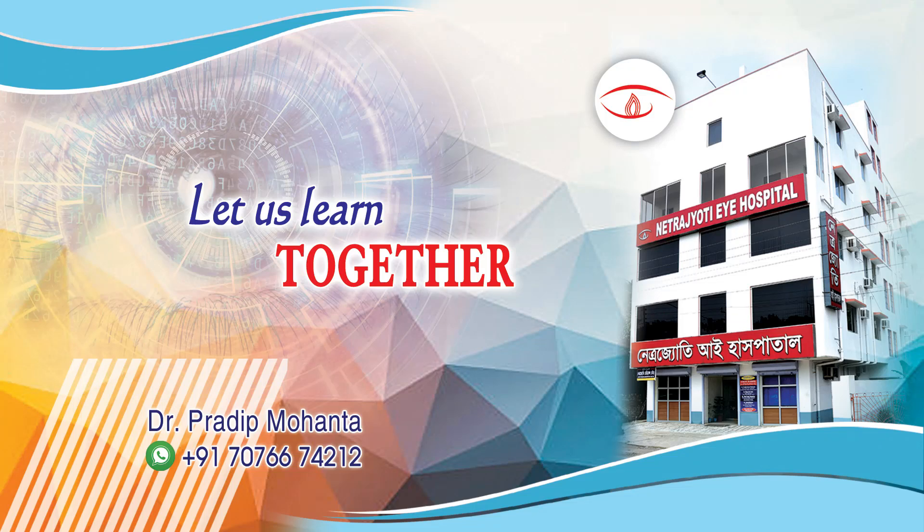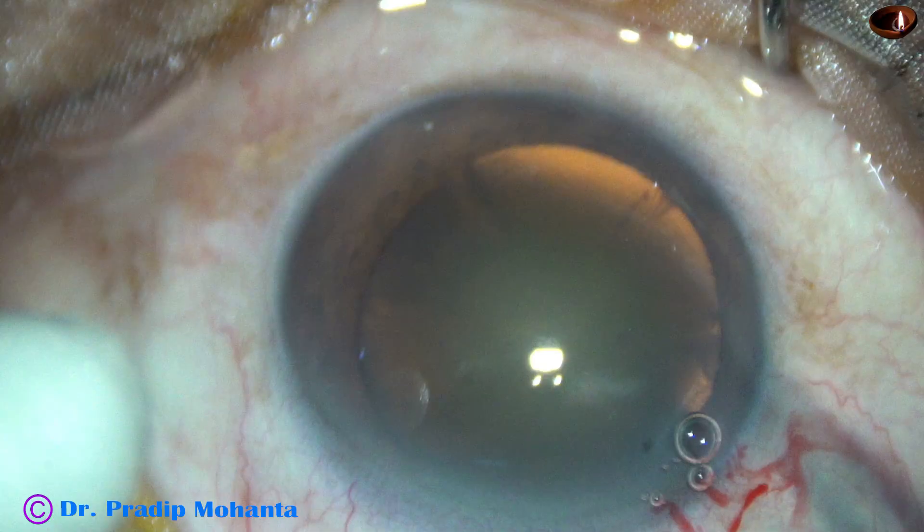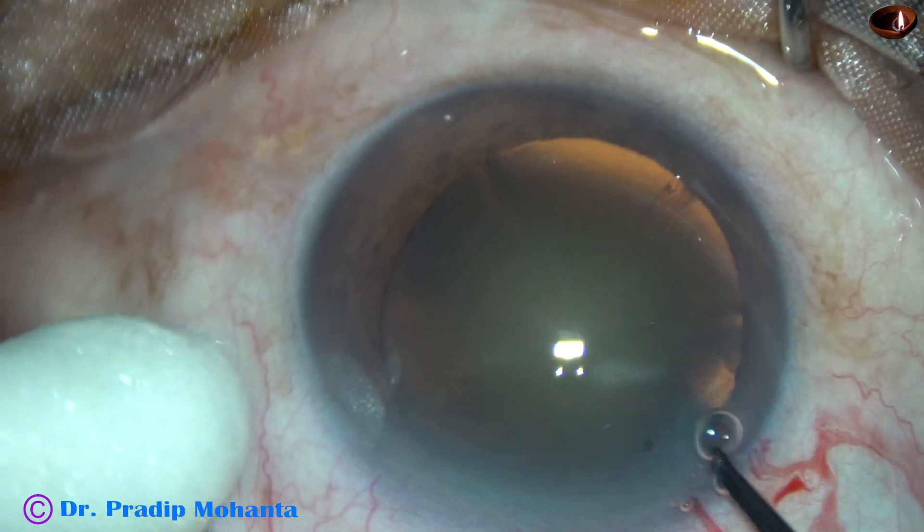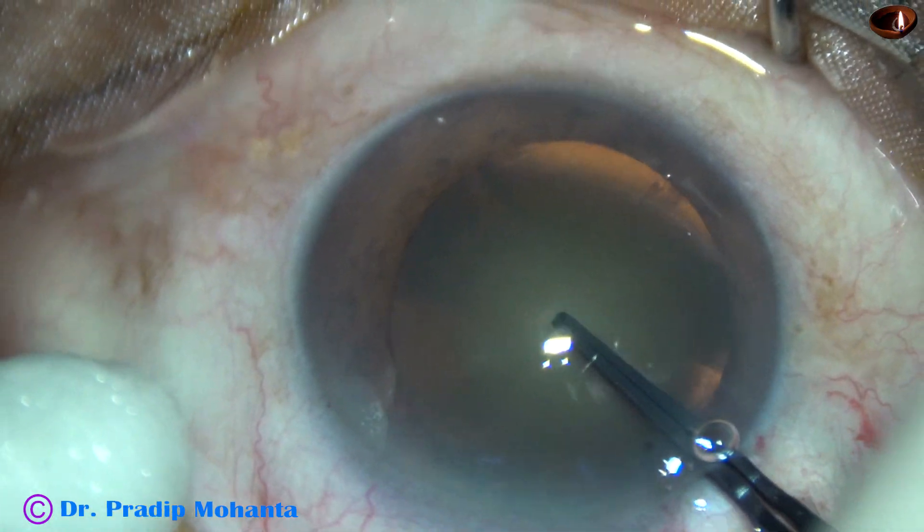Friends, welcome to my workplace at Rana Gahat, West Bengal, India. This is a cataract with grade 2 plus nuclear sclerosis. There is history of trauma. Let us see what happens as I do capsulorhexis.